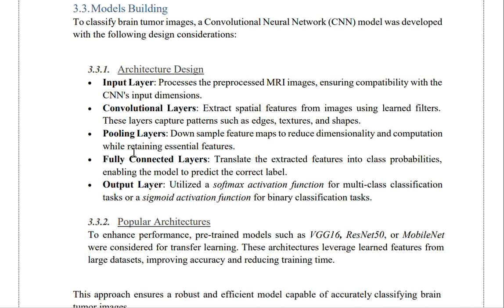In the model building, to accurately classify brain MRI scans into tumor or no tumor categories, we design a CNN model that extracts spatial patterns from image data.